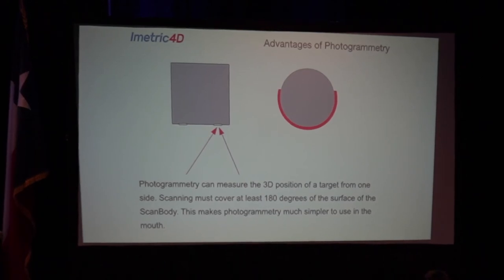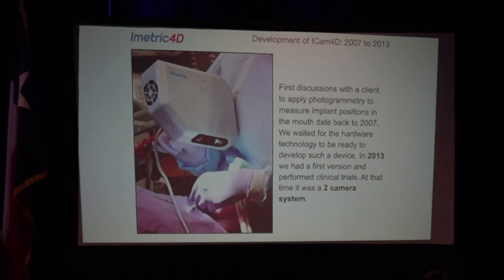So that's what it's showing. When you're taking an impression, if you have 8 implants in the back, I just pan around there and I'll do it real quick. An intraoral scanner, you've got to get usually all around so it can stitch together. So this is the difference between the Pic, where, yeah, how much time's left? Because that's not moving, that thing's staying. 15 minutes.